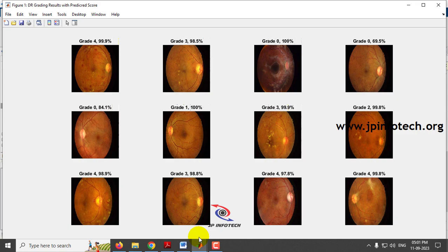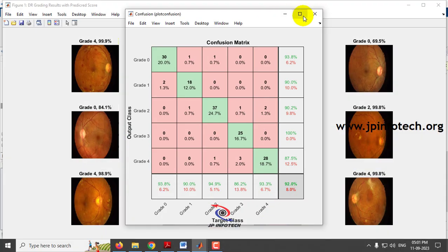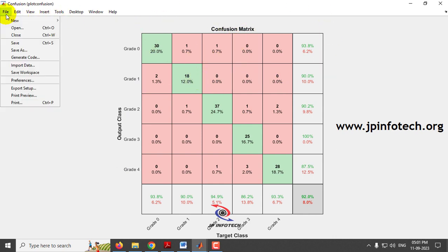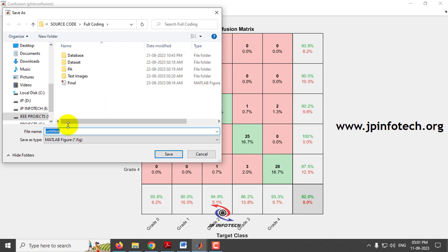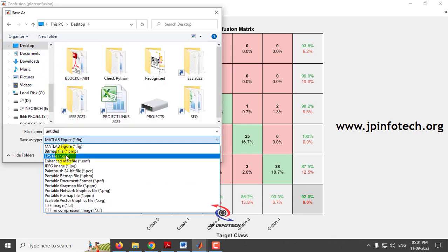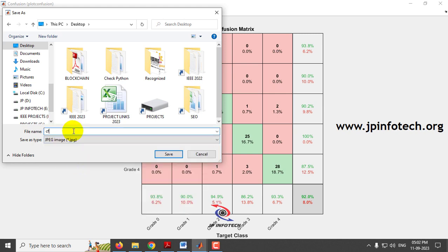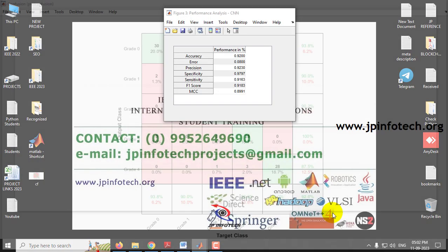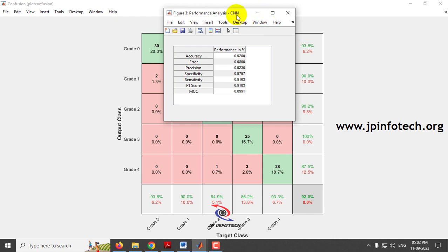The confusion matrix is displayed next, showing true versus predicted labels for all five classes: Grade 0 through Grade 4. To save this result, go to File > Save As and save as a JPEG or preferred format on the desktop — for example, saved as 'cf'.